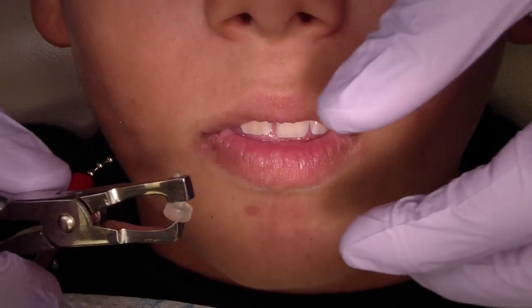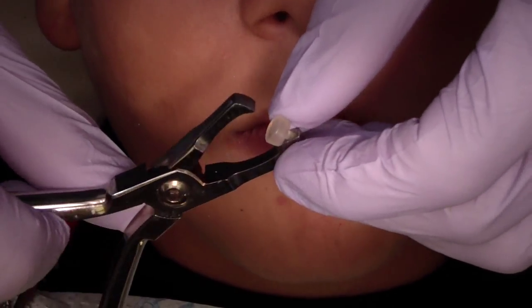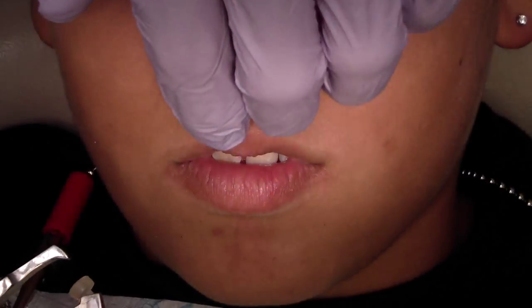You can also remove the band using the band removal device — band removers — and this just goes at the gingival third. Let's get you to open for me.